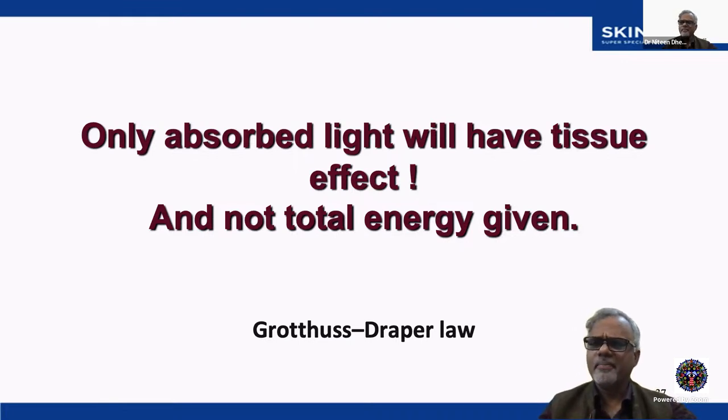So how many joules you give, that's useless. Anything which is absorbed in the target molecule has a clinical effect. This is called the Grotthus-Draper law.